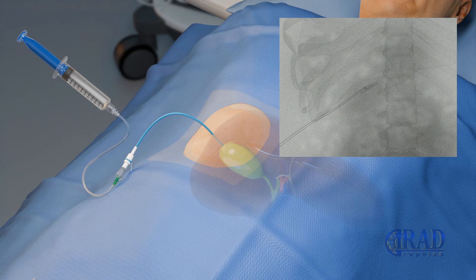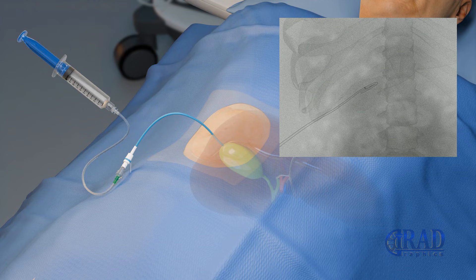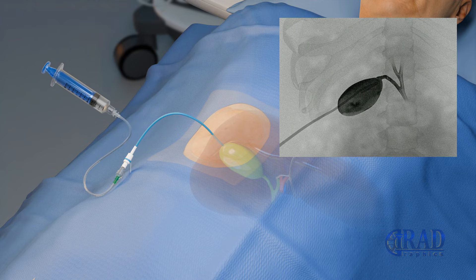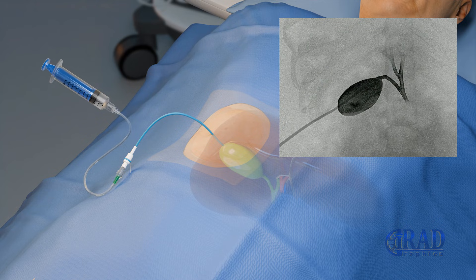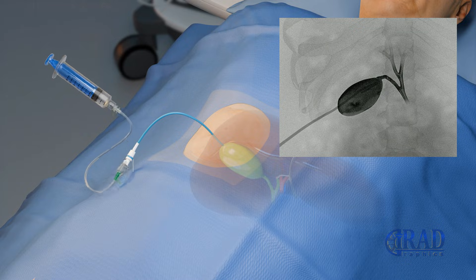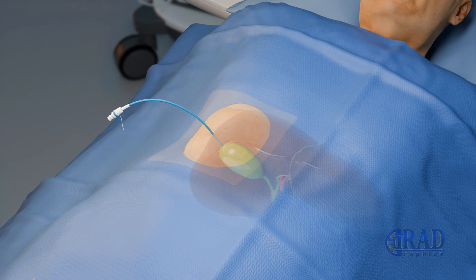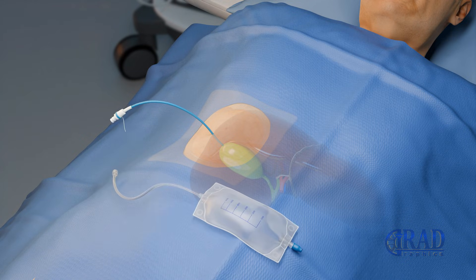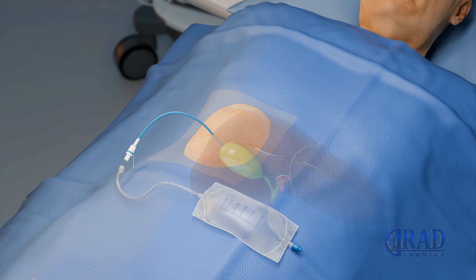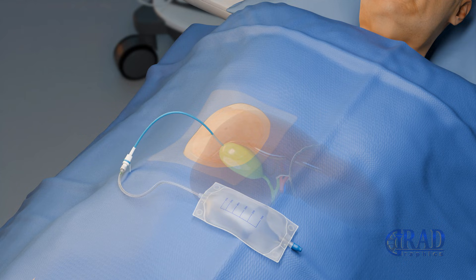The position of the drain within the gallbladder and patency of the cystic duct are confirmed by injecting contrast. Subsequently, the drain is connected to a gravity drainage bag for 24 to 48 hours before being capped.